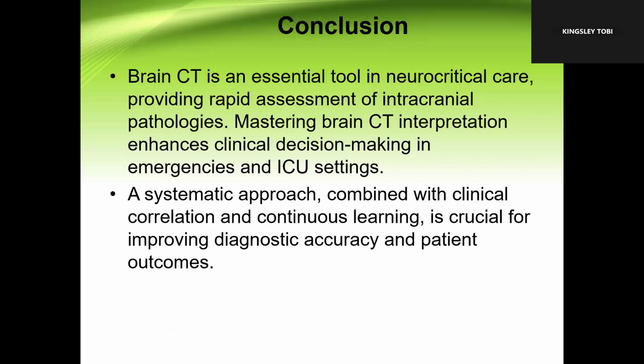So in conclusion, brain CT is an essential tool in your critical care, and it provides a rapid assessment of intracranial pathology. Mastering brain CT interpretation enhances your capacity for clinical decision-making in emergencies and ICU settings. Remember to always follow a systematic approach and combine your CT imaging with clinical correlation, and continuous learning is important.